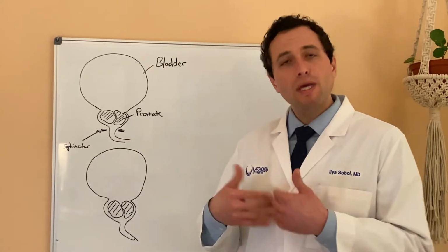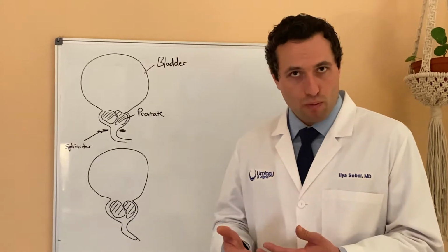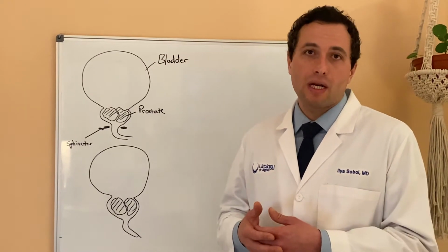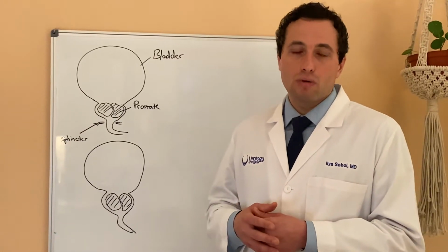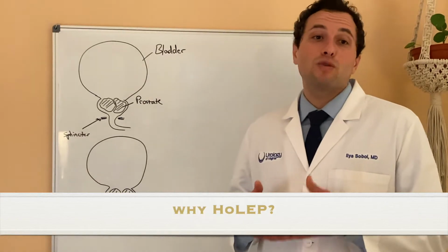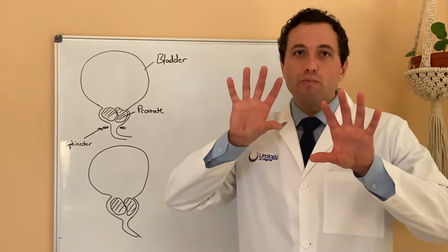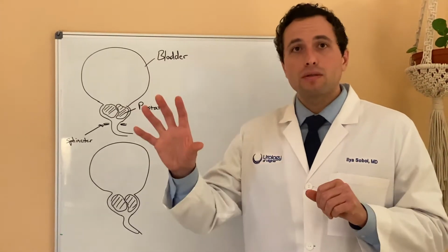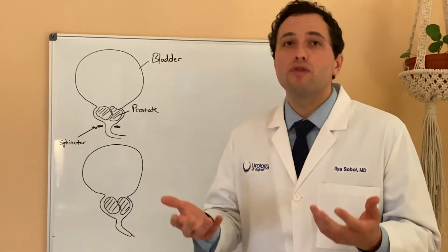So we're skipping ahead here and we're saying you've already seen a urologist, you've had the appropriate testing done, and we've come to a conclusion that you have this diagnosis. And one of the options for this problem is Holmium laser enucleation. So let's talk about the reasons why somebody would want to have this procedure. Really, you can divide it into two major groups. The first is the medical reasons, and the second group is the reasons that you want it, meaning you want to improve your urination.